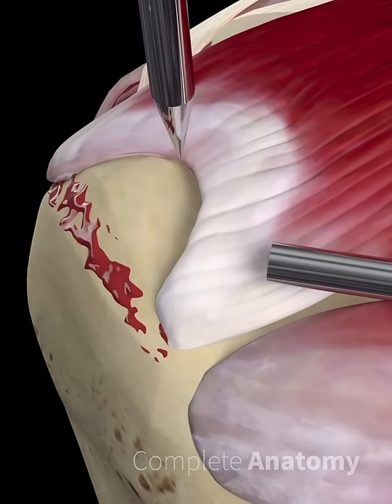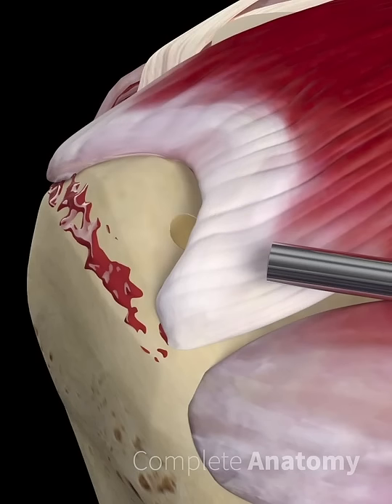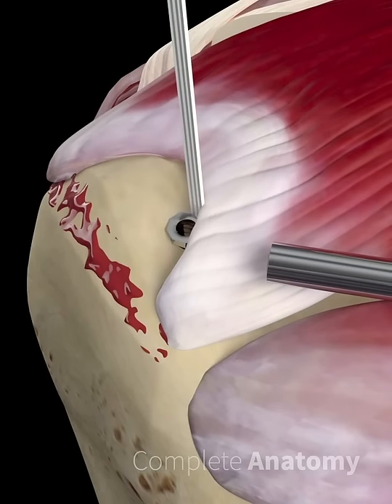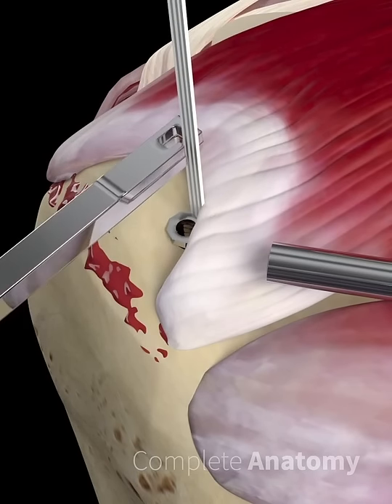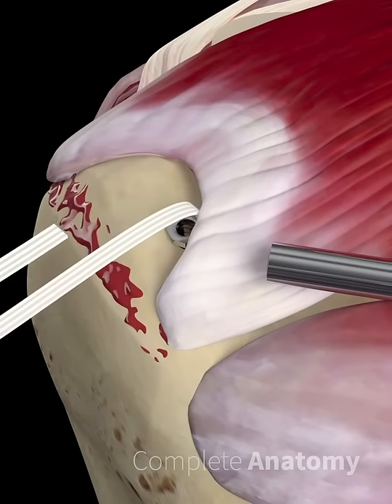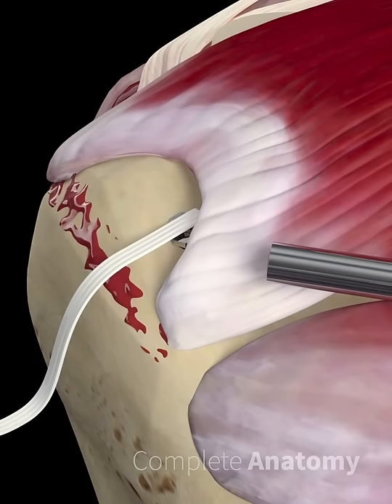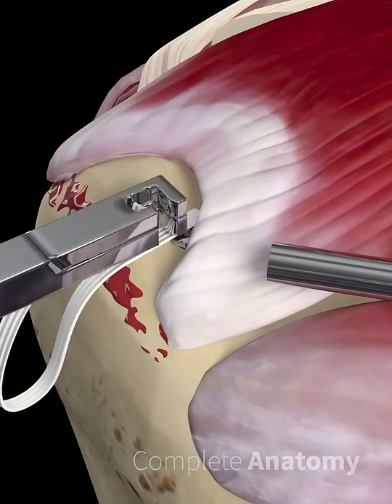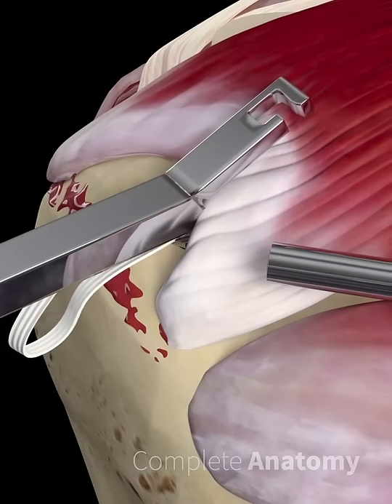Holes are drilled and suture anchors are embedded in the bone at the natural attachment site of the tendon. Sutures are brought through the tendon and are fixed to the anchor sites.